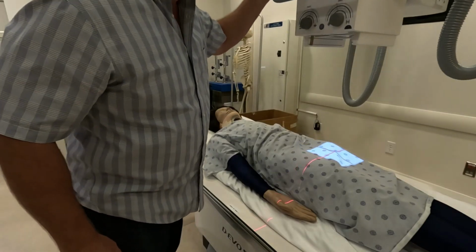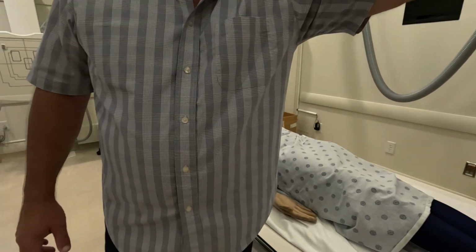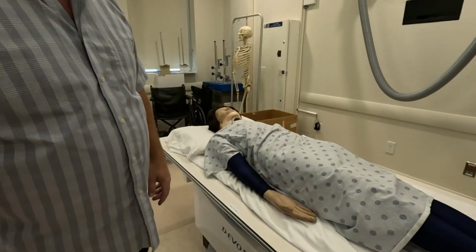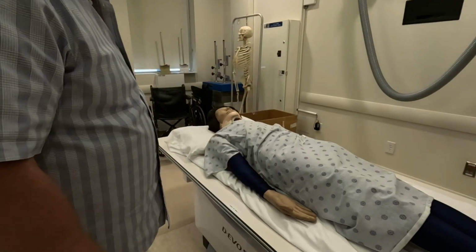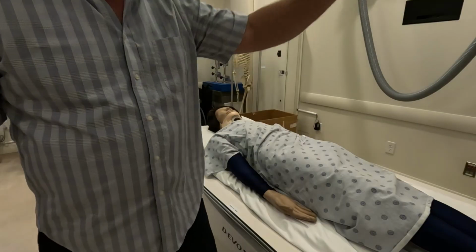Before you get the patient into the room, what you want to do is get the X-ray tube out of the way. If the patient hits their head on the X-ray tube, that's going to be an incident report. So you want to get it out of the way, have the patient get on the table and lay down before you put the X-ray tube over them.